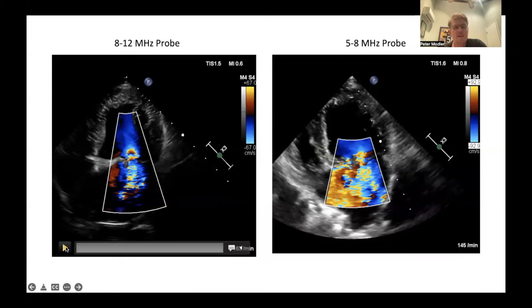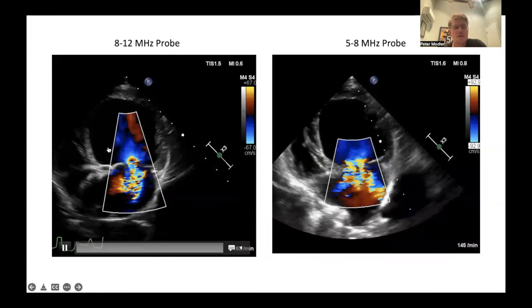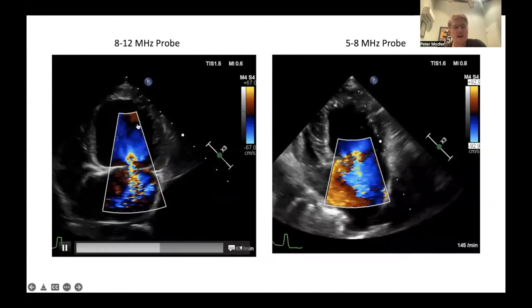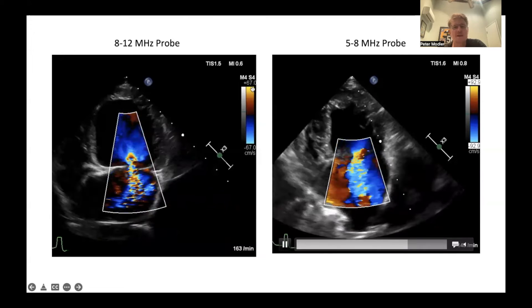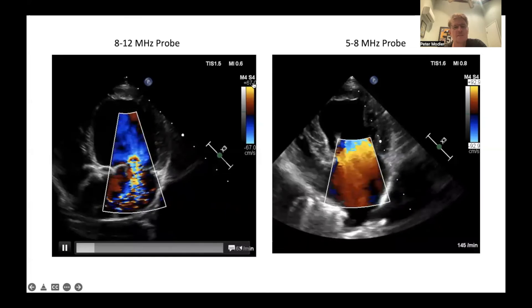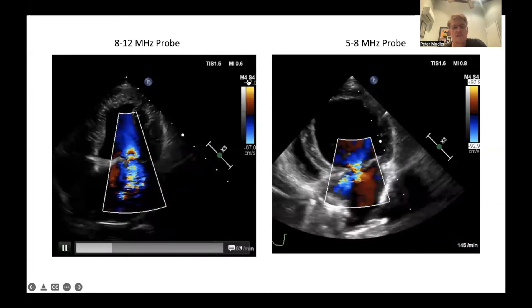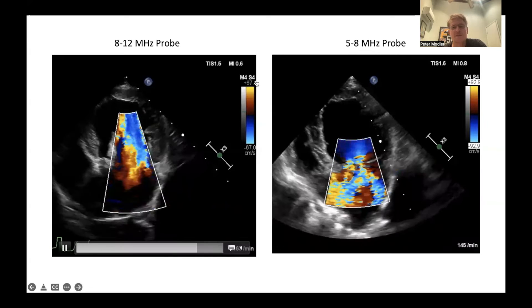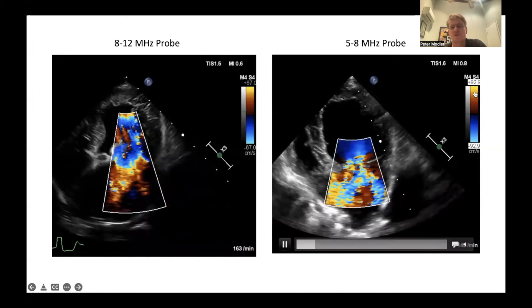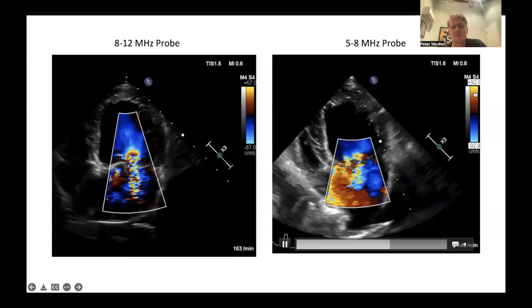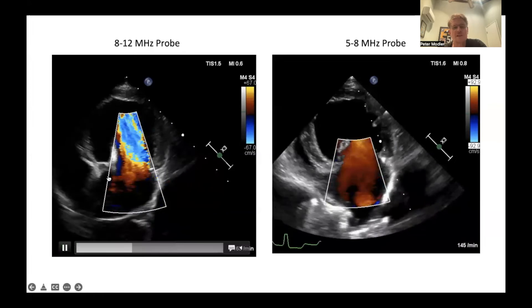This is demonstrated in an apical view with the same dog. On the left side with the high-frequency probe, the maximum Nyquist limit achievable was 67 centimeters per second; on the right side with the low-frequency probe it was 92–93 centimeters per second. On the right side you see much more color than on the left side, confirming that probe frequency choice significantly impacts color Doppler jet visualization.